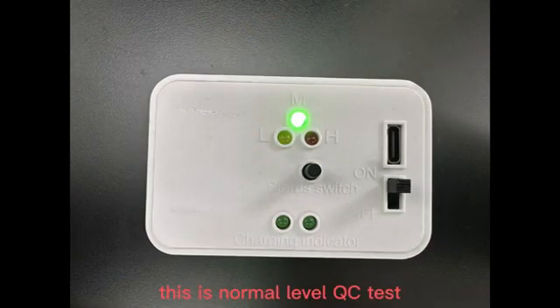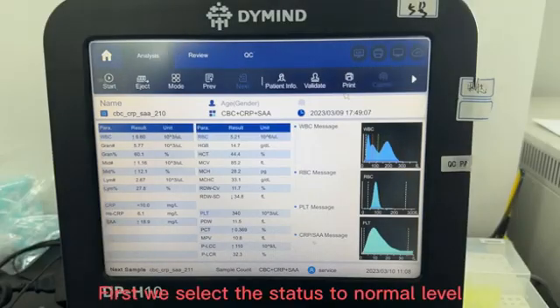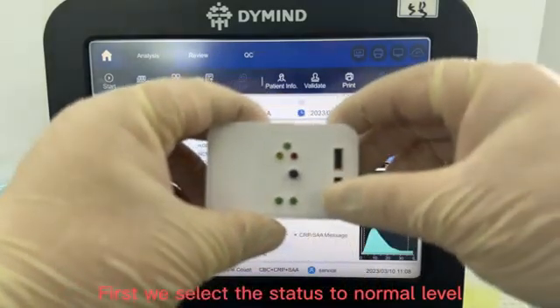This is normal level QC test. This is high level QC test. First, we select this to normal level.